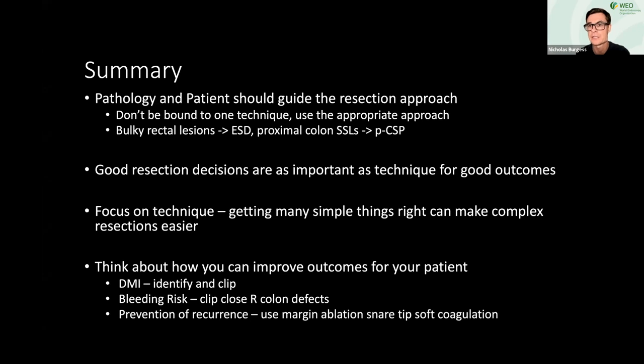For DMI, identify that and clip it. For bleeding risk, proximal colon clips are very important. And to prevent recurrence, use margin ablation or some form of snare tip soft coagulation.